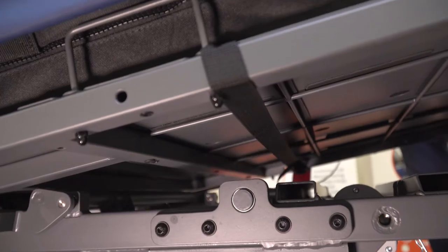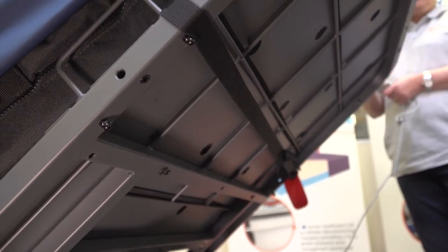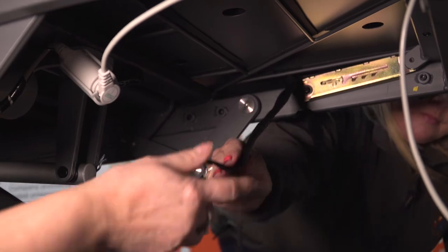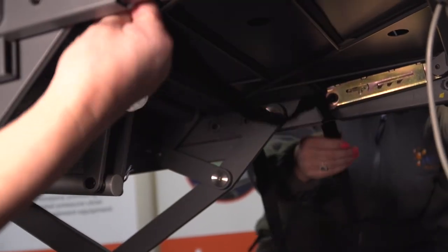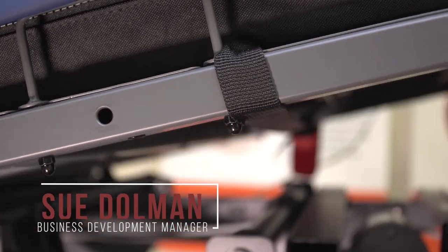This complies with even the strictest of infection control protocols. Upon installation, it is important to ensure that the securing straps are attached to the moving parts of the bed frame — for example, the knee break and the backrest. Never secure the straps to the outer edges of the bed frame, as this will damage the mattress and the bed.